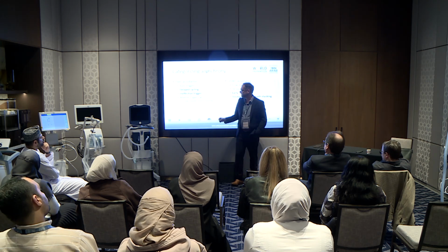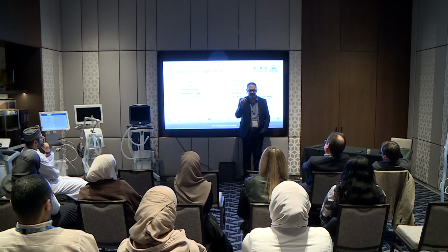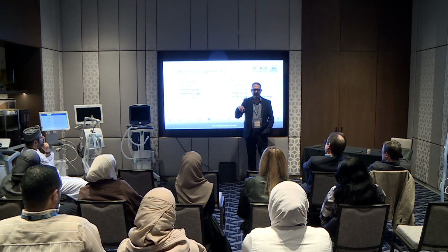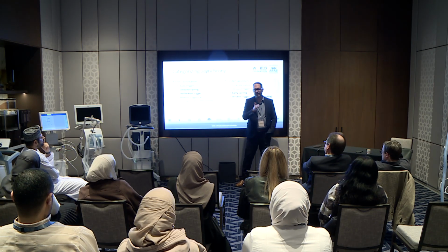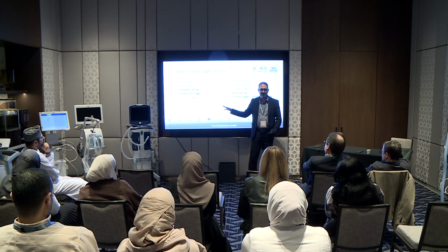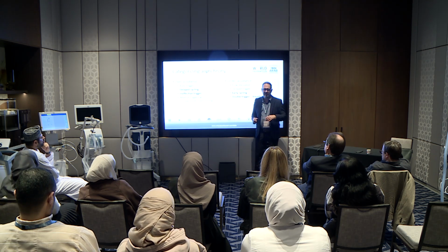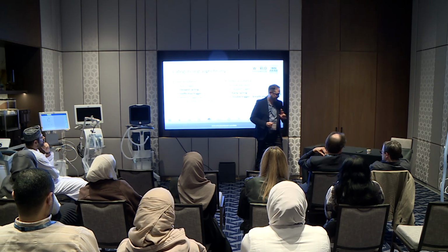It's auto triggering, right? Reverse triggering is a difficult one for calling it over assistance because maybe the volume's okay and the rate is okay, but in some patients, if you just lowered the respiratory rate, the patient would now trigger every breath and they don't have reverse triggering. It's a phenomenon, the patient's trying to entrain with the ventilator, and if you just lower the rate, the patient can take over. In some patients, when you do that, they actually have no drive without the stimulus. Without the ventilator pushing and they respond, some patients you put them on pressure support and it's apnea. Okay, so in those patients, I wouldn't say it's over assistance, you're probably over sedated because this happens commonly in sedated patients, this reverse triggering phenomenon.